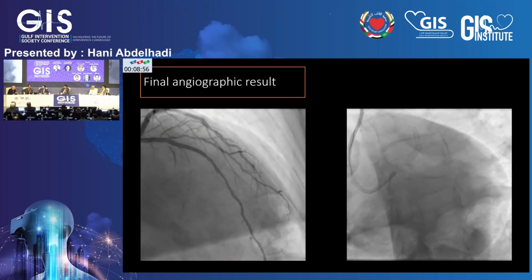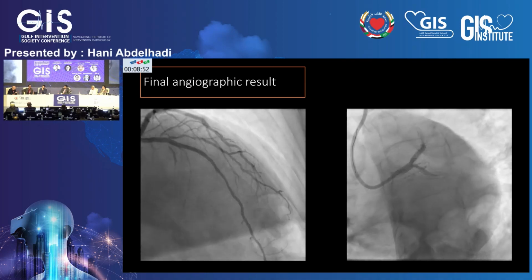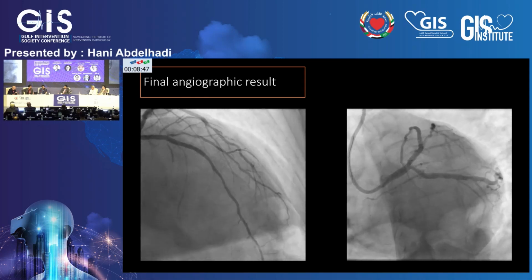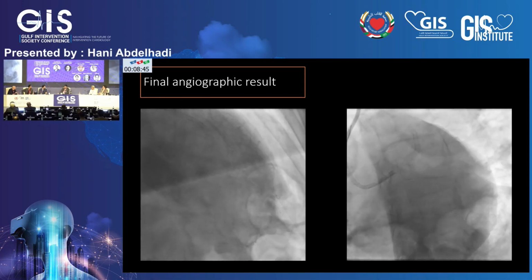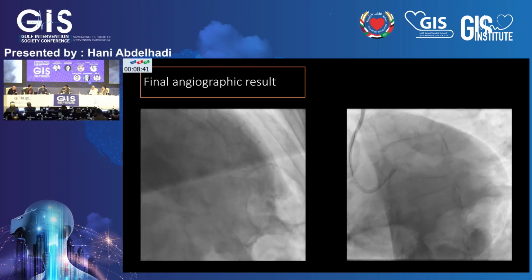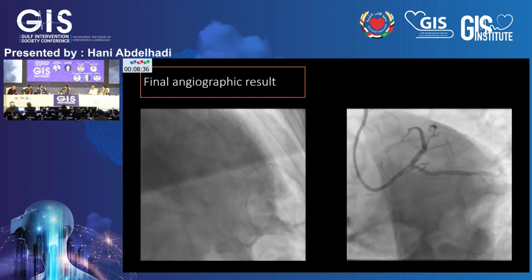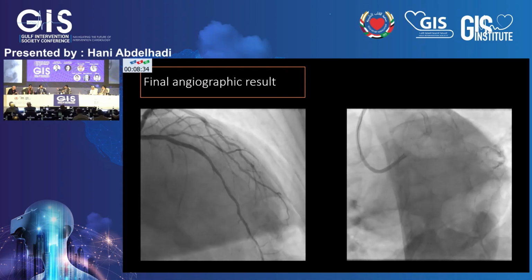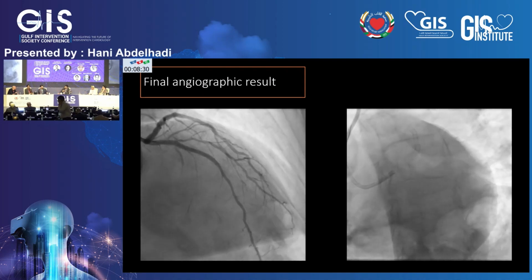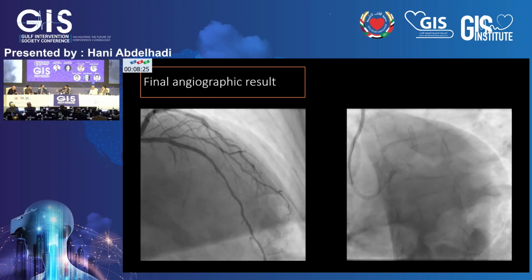You know, I would also say on that note that perhaps the modality to assess the acute result is a physiological result rather than an imaging result, right? Yeah. I think what's driving people shy is what you actually wrote in what's acceptable results post-PCI from the MLD max. And they are using the same phenomena of, how long is the dissection, what's the depth of the dissection. And it's created confusion of what is acceptable to leave after the case.